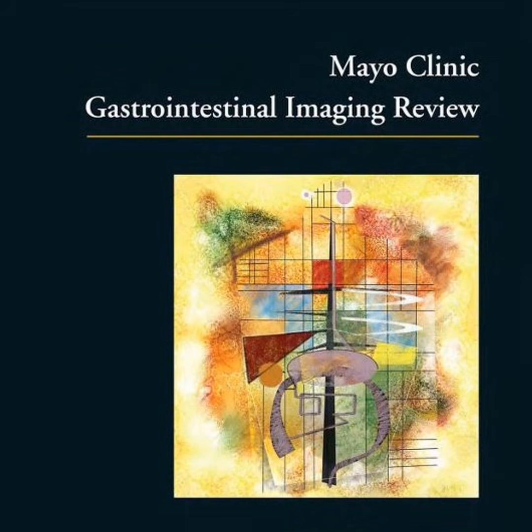Right. You have a patient with colon cancer, and a CT scan reveals multiple tiny hypodense lesions scattered throughout the hepatic parenchyma. Every clinical alarm bell rings. Because colorectal cancer loves to metastasize to the liver via the portal circulation. Exactly. But as we hinted earlier, those lesions could very well be von Meyenburg complexes, otherwise known as biliary hamartomas. And as medical professionals, we know hamartomas are entirely benign developmental malformations. They're just small clusters of disorganized bile ducts embedded in a fibrous stroma. They carry zero malignant potential.